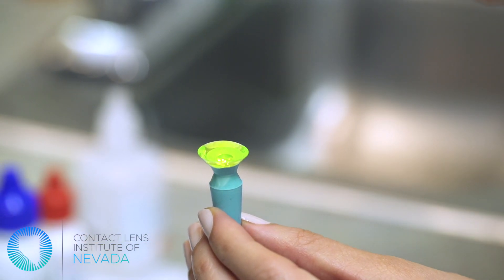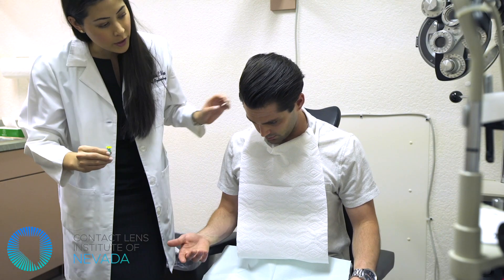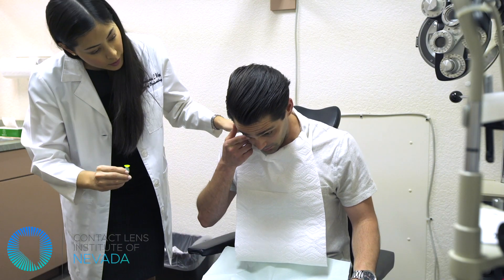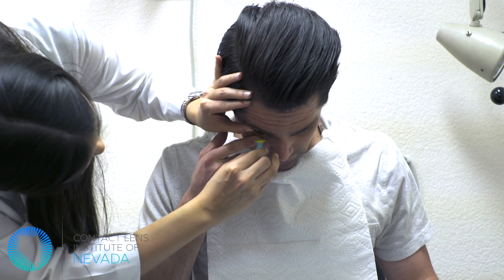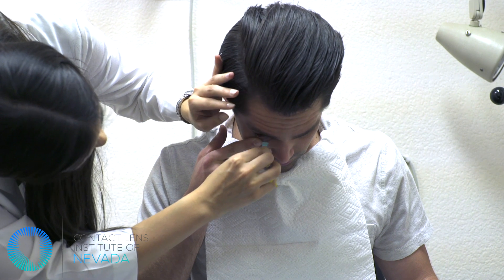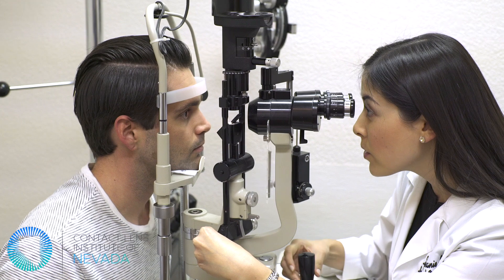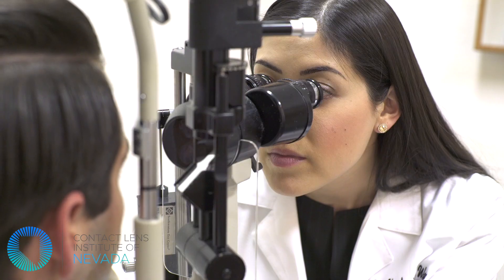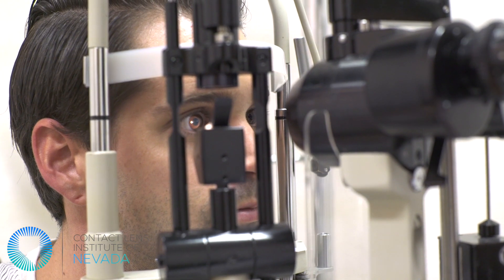The yellow dye will help with the assessment of the lens fit. Most practitioners will have you look at the ground and have you assist — you will hold down your lower eyelid while they control your upper lid. While maintaining your gaze to the ground, the practitioner will apply the scleral lens with a smooth, quick motion. After the lens is applied to your eye, your doctor will view the lens fit and see if any changes are necessary.